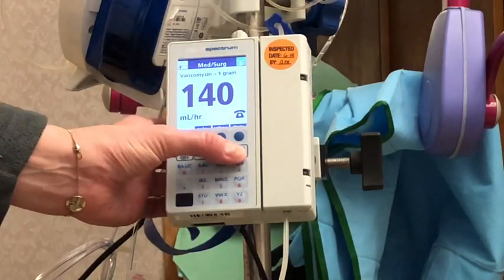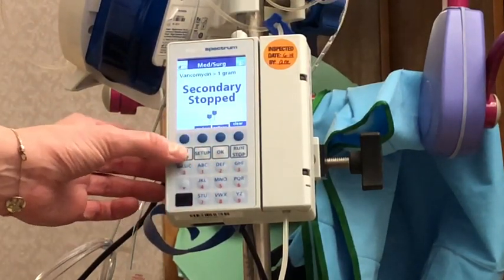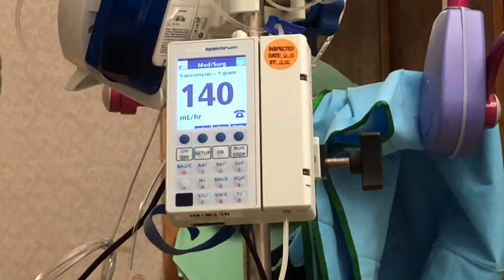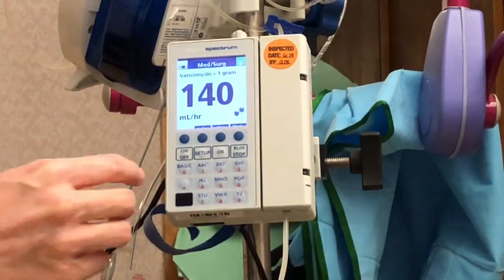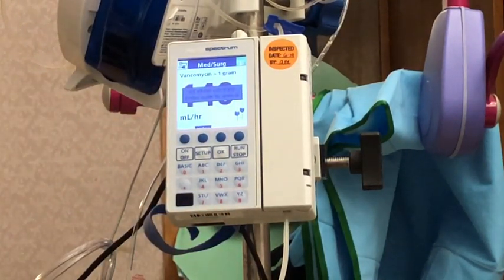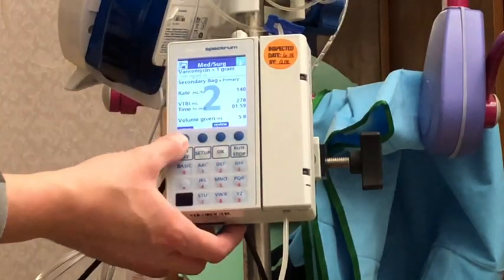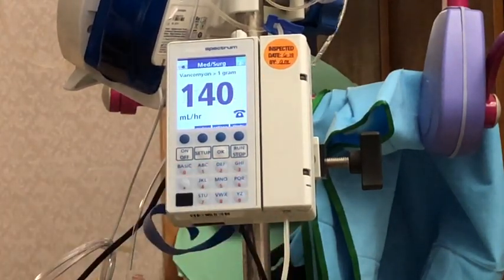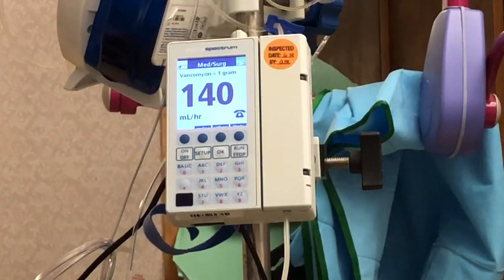If I wanted to lock the keypad, the code is 4-2-9. I enter 429, hit okay, and I'll get a message that the keypad is locked. When the keypad is locked I can still review my programming, but I cannot start or stop the pump. To unlock the keypad I use that same code — 429 — and now the keypad is unlocked and I can go in and adjust settings.